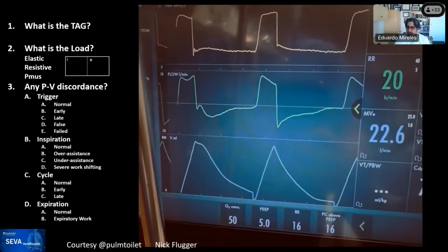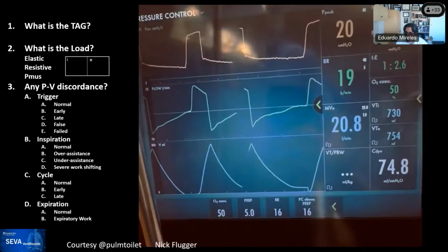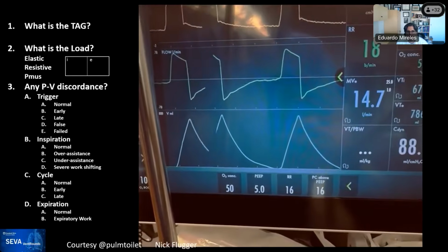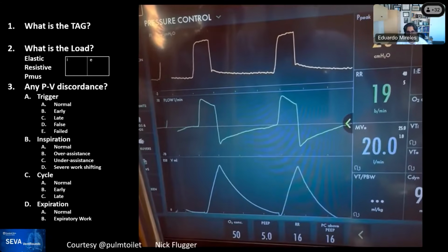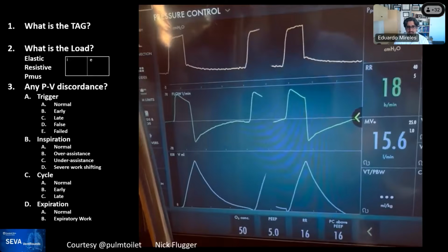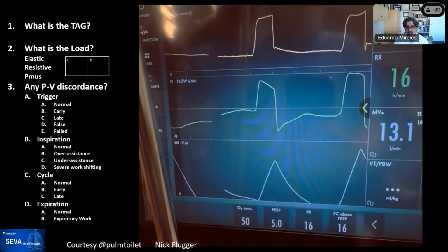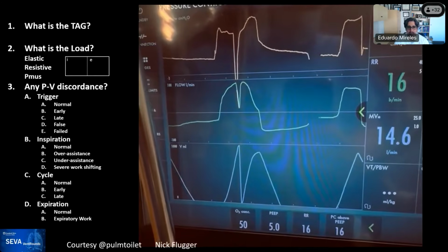So I'm seeing some comments come out. The first one that came out was auto mode. If we place this patient on auto mode, when the patient goes into apnea, the mandatory breaths would come in. When the patient starts breathing on their own, the mandatory breaths get turned off, and then you can set the amount of pressure support. So you could essentially put it out of it with very little support.